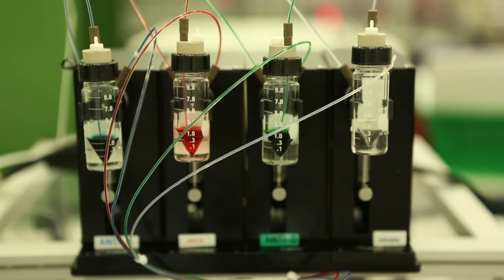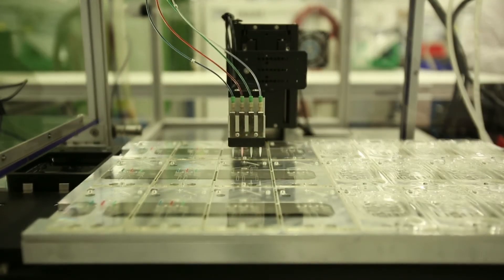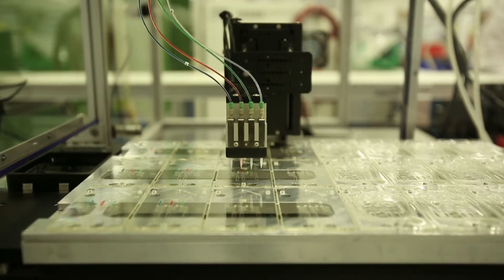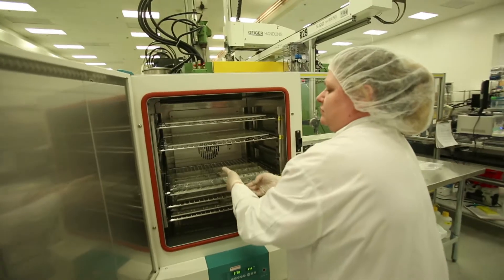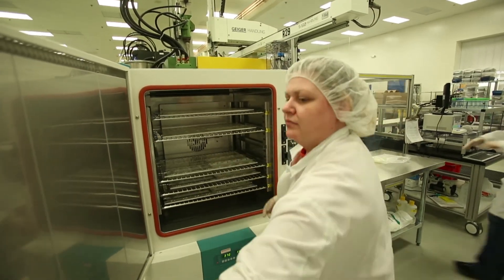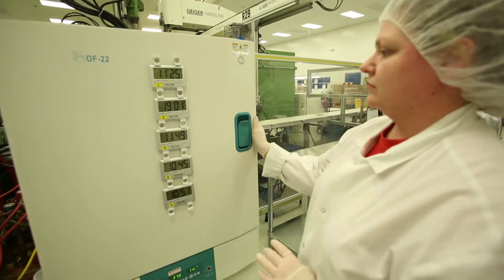The tray is then loaded into the BioDot system where the antibody and flow inhibitor formulations are printed in very small amounts onto specific locations on the cards. Once the BioDot has completed the printing cycle, the tray is then loaded into the oven where the formulations are set and dried.